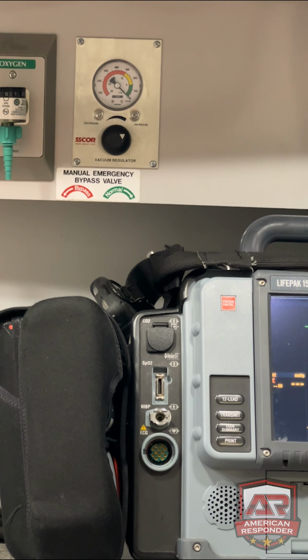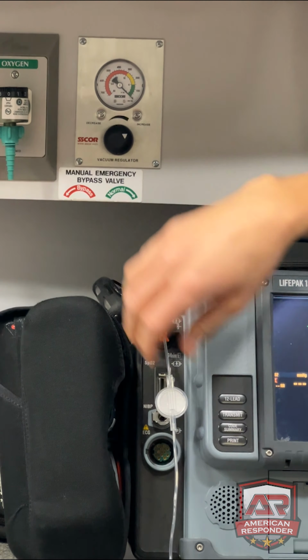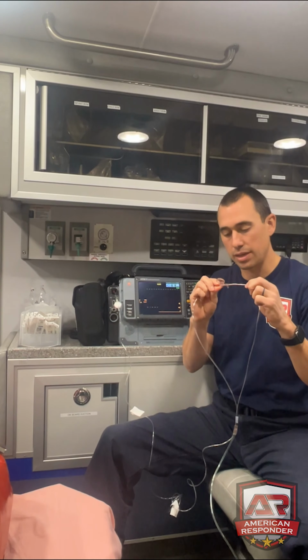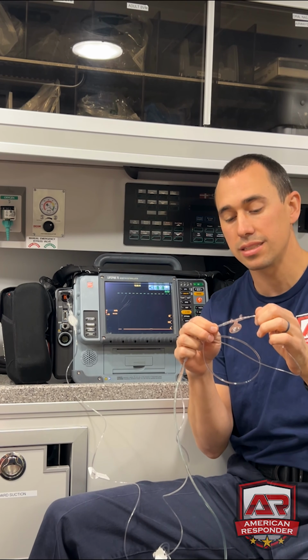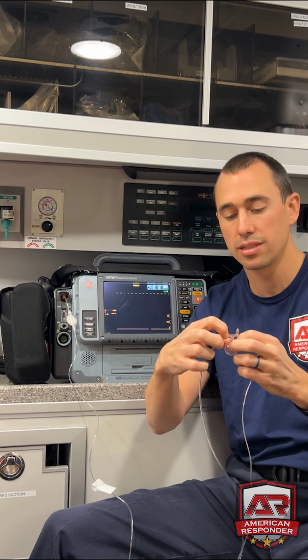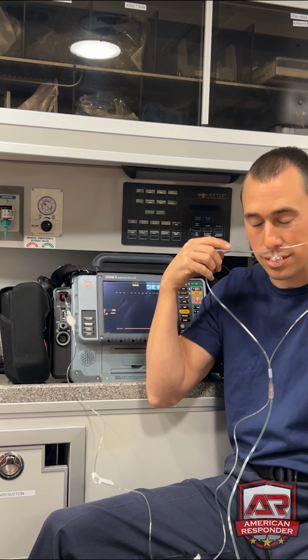All right, so first, you're going to plug in here. Okay. Now we're going to put it on our patient, which is me today. The cool thing about these is that, depending on what style of nasal capno you have, you can apply oxygen through them. Typically, most are blow-by oxygen. This one isn't, this one goes into prongs, but a lot of times they have little dots at the top of your prongs, right here, and that's the blow-by oxygen. You don't want to put on more than 4 liters per minute because it will wash out your capno.